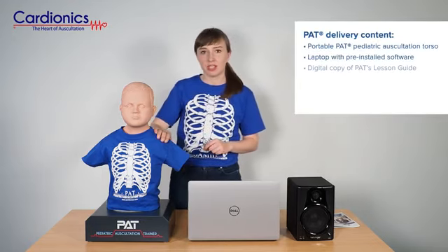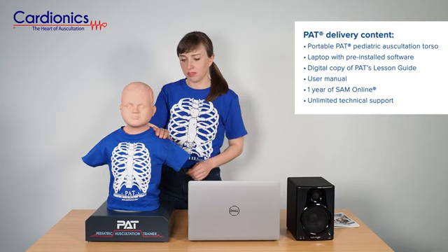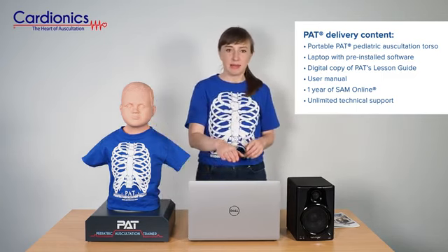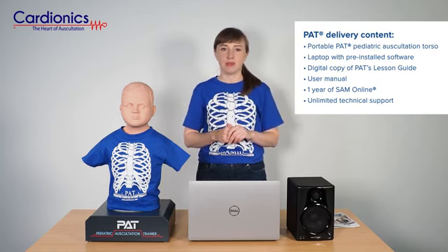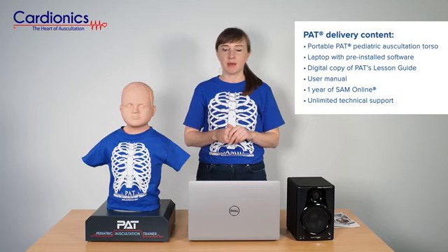PAT auscultation training torso, which is mounted on a base and comes with a t-shirt. A laptop with pre-installed software, which allows you to access Cardionics' library of heart, lung, bowel, and body sounds, as well as set up programmable and password-protected lectures and exams.